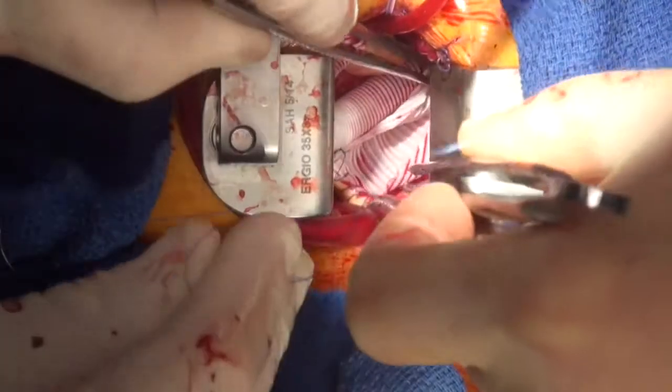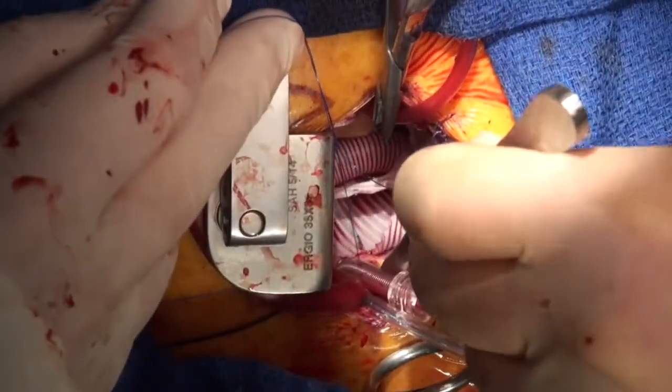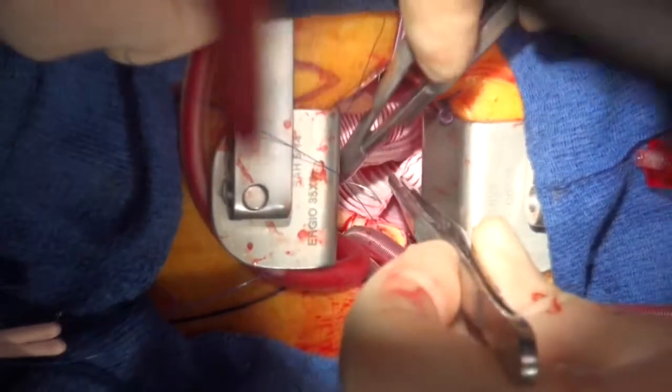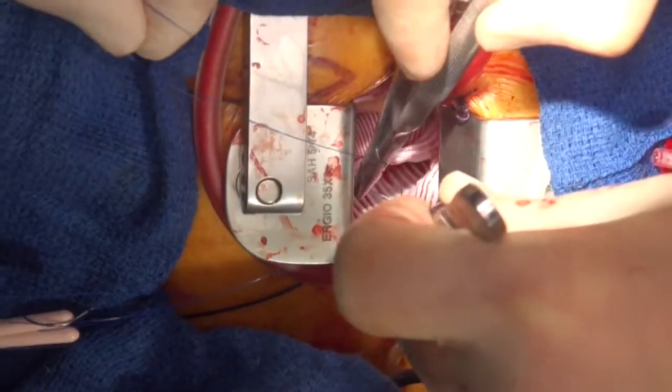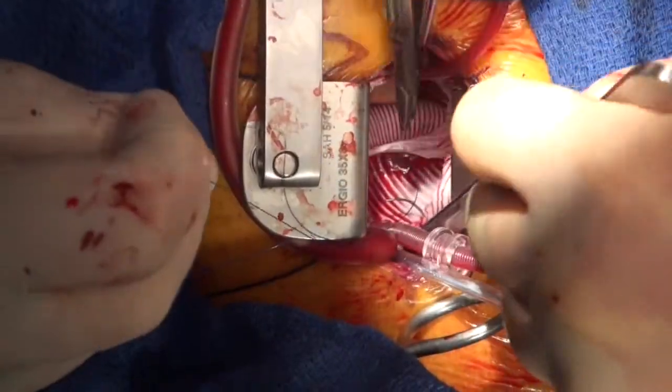We're just doing the back wall. At regular intervals he stops his suturing and uses the hook to really tighten every single suture. This is especially important on the back wall, as it really isn't reachable post-operatively.